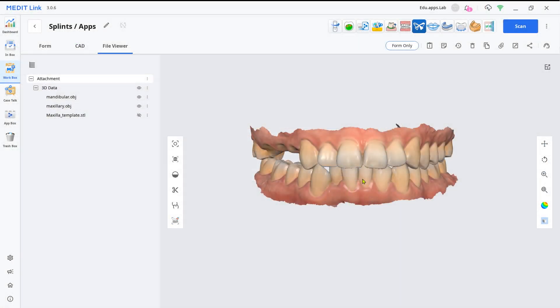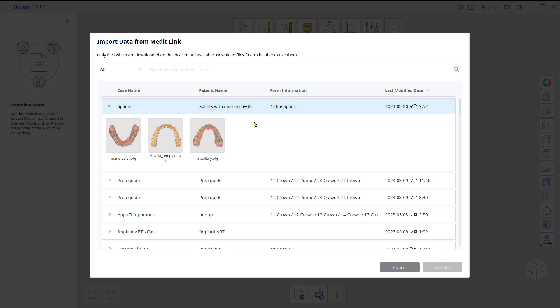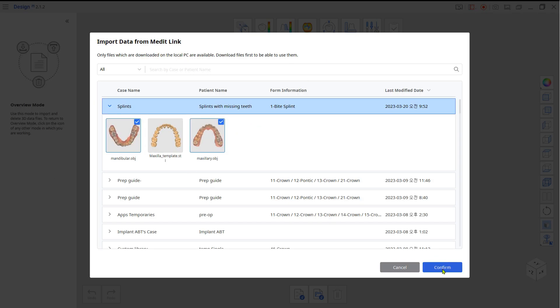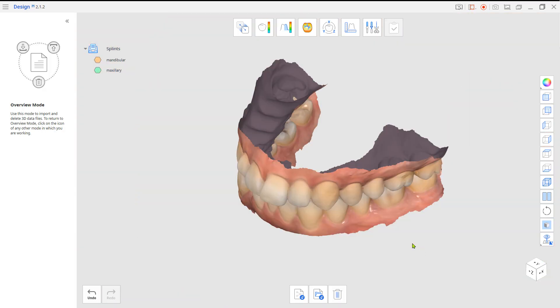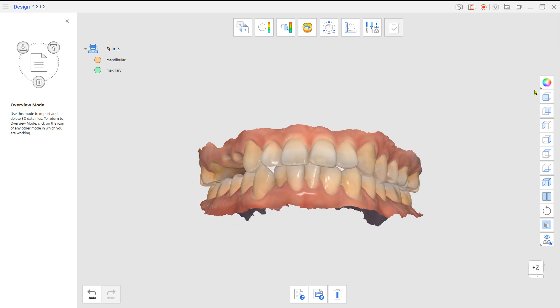First, by using teeth from the other side of the mouth. If the scan data has teeth on the other side, you can duplicate and mirror them for the empty space.